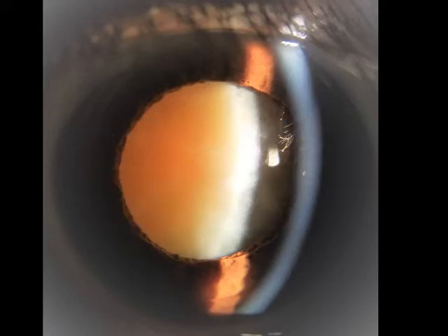Then you will be brought into the operating room where the nurse will prep your eye, eyelids, and surrounding skin with a cleansing and sterilizing solution. A sterile drape will be placed, and a metal lid speculum will help keep your eye wide open throughout the procedure. During the surgery, more IV sedation can be given if you are not relaxed enough, but we do not want you too drowsy because we need you to cooperate with us and not make any sudden movements.